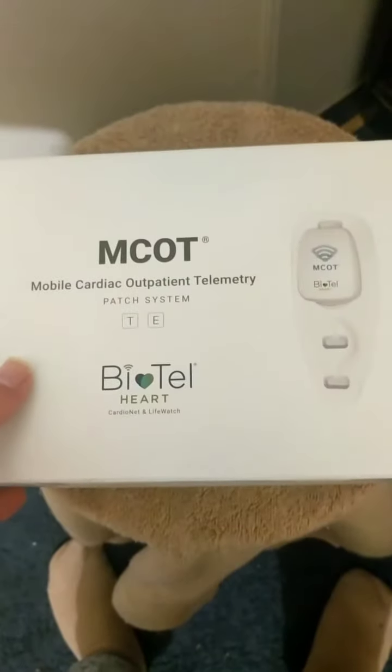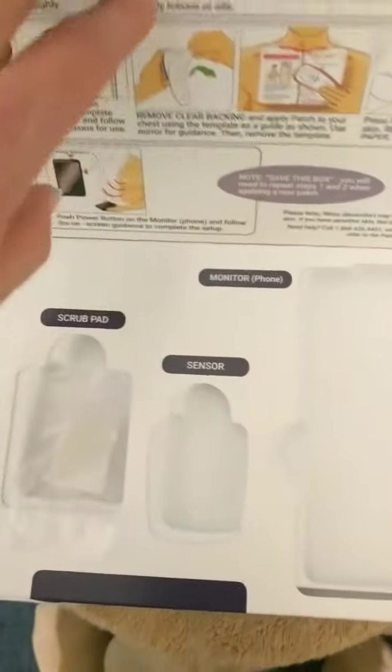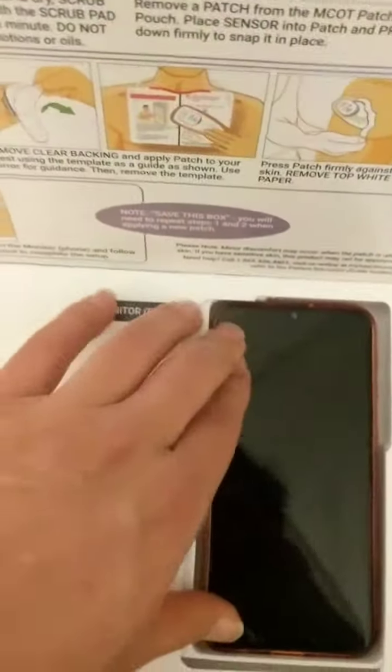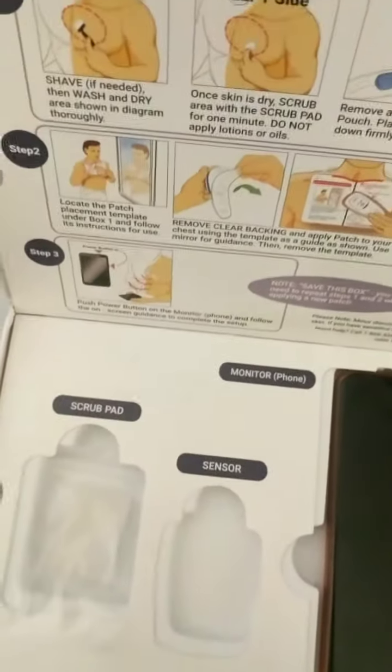So I've got this box. There's three boxes. The first box — the phone goes right there. And there's a little scrub.